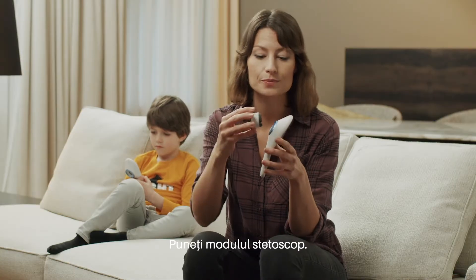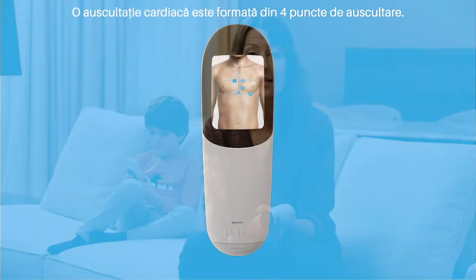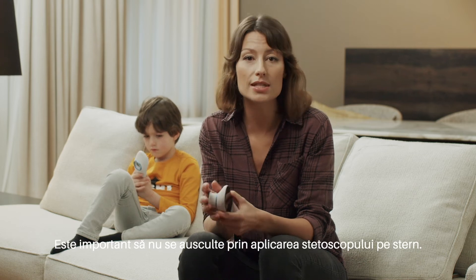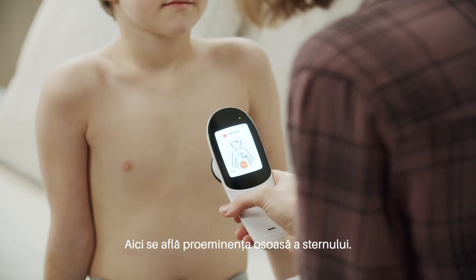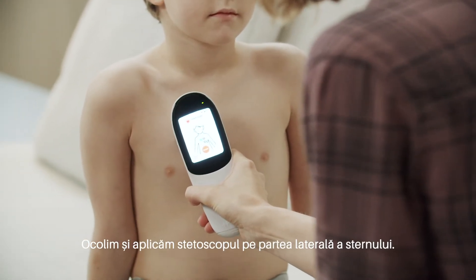Attach the stethoscope module. The heart is auscultated at four points. Please note that the first point is on the right side of the chest. It is important not to place the stethoscope against the sternum. Here's the sternum — make sure to place the stethoscope next to it.